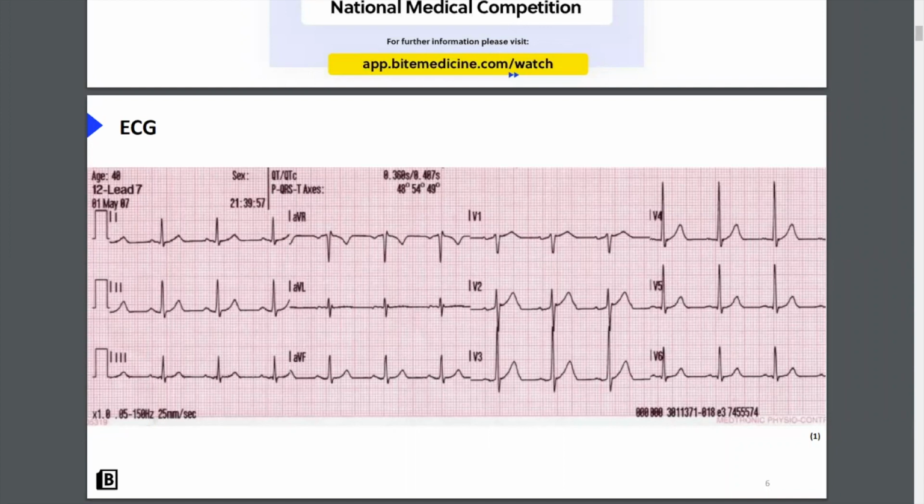It's the $1 million question. You all know that there are 10 electrodes, and you all know that there are 12 leads. But why then do we have 12? Why do we have 12 things appearing on this ECG, but only 10 electrodes? Vectors, yes. People said triangles, vectors, exactly. So we'll get onto that. That's the most difficult concept of ECGs, understanding that the ECG is not a single recording, but it's a vector looking at movement of essentially electricity or depolarization across the heart in different planes.